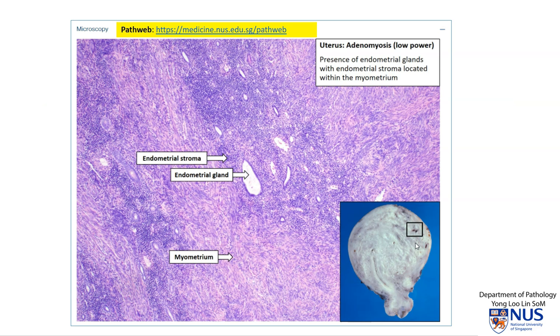Microscopically, we look in the myometrium for abnormal areas — specifically the presence of endometrial glands and stroma. This whole area is an area of adenomyosis, and we can see the presence of endometrial glands, which are lined by a very bland, benign columnar epithelium, and the surrounding stroma which is bluish on low magnification. It looks different from the surrounding myometrium, which appears pink with fascicles of smooth muscle cells that have quite abundant cytoplasm.